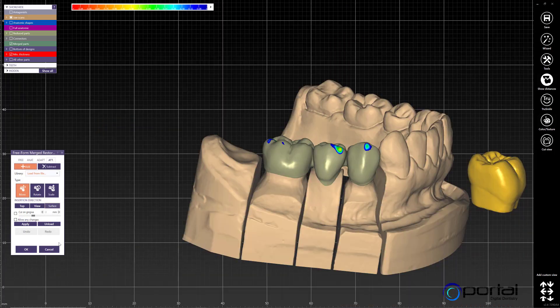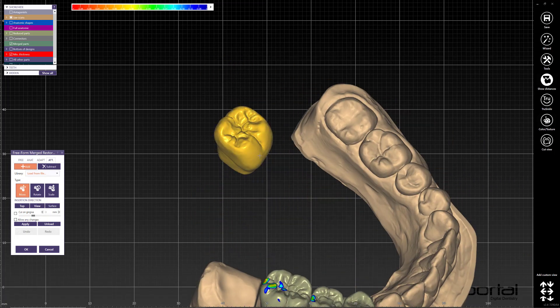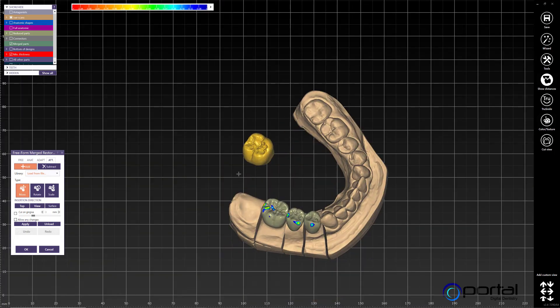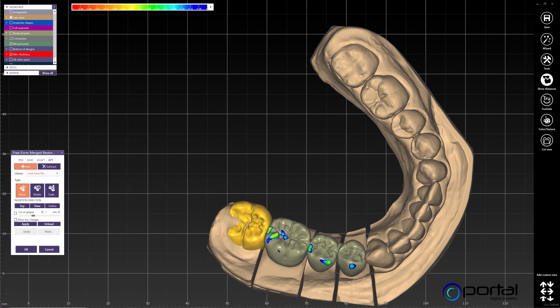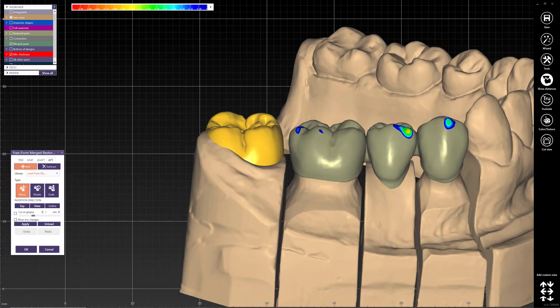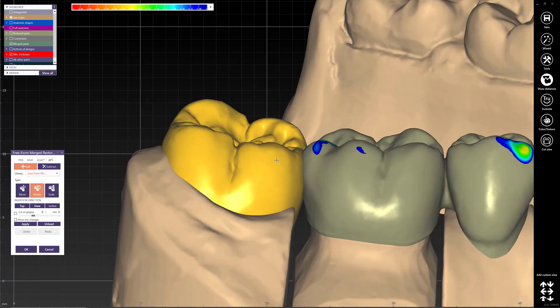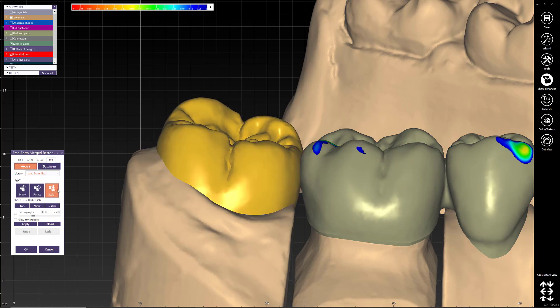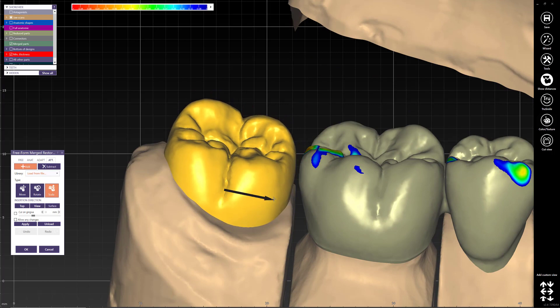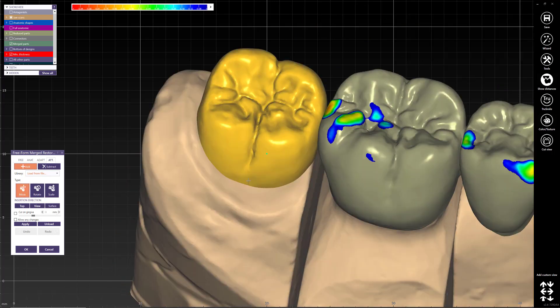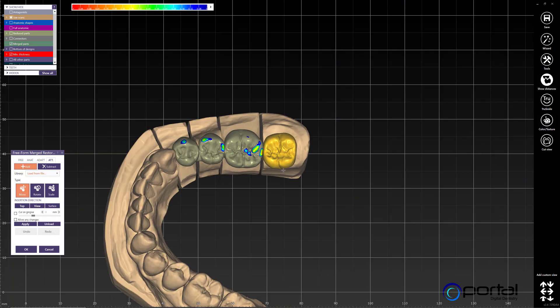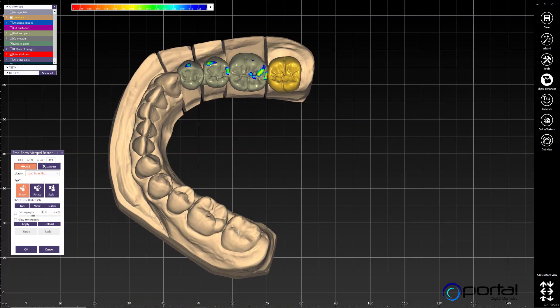This would be a number seven, so I'll double-click on that and it'll pull it in. It's going to take a little free-forming to move it around, and it doesn't move as intuitively as a regular tooth model does. To rotate, I use the rotate control; to move, I go back to move; and to resize, I go into scale.